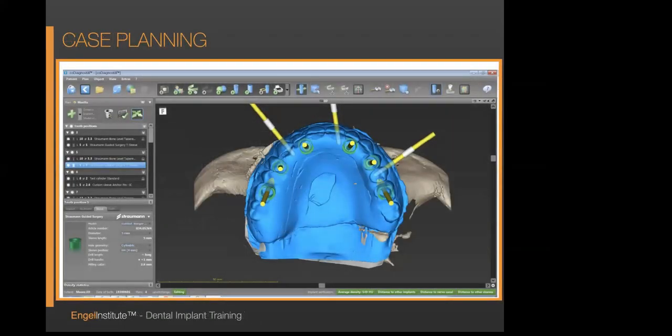So this is where you take the 2 files, you go on a webinar or go to meeting with them, and they get pretty quick after a while. They input your defaults. So do you like this? Do you like that? Do you place your implants subcrestal? Do you like them at the crest, etc.? So the planning will typically get easier and easier, and you will have your own agent, so to speak, at the other end that will help you, and they will understand your needs pretty well.